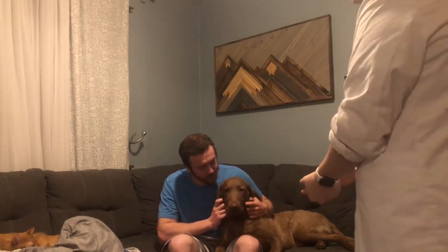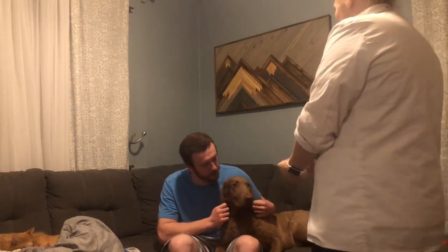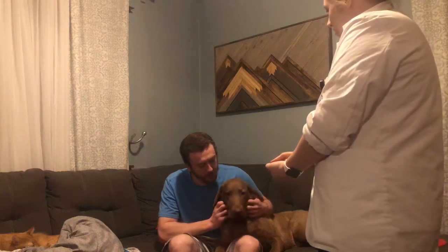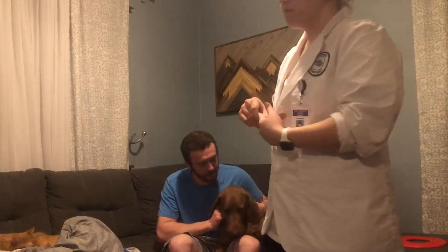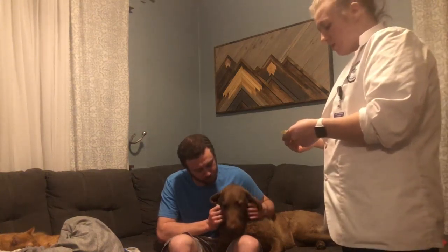Hi, I'm Lizetta. I'm an LSE nursing student. I'm going to be performing an oral throat swab on you today. Can I get your name and date of birth? Cody Cruz, 8-15-93. I'm just going to check your medical bracelet and I would check my medical record on the computer.